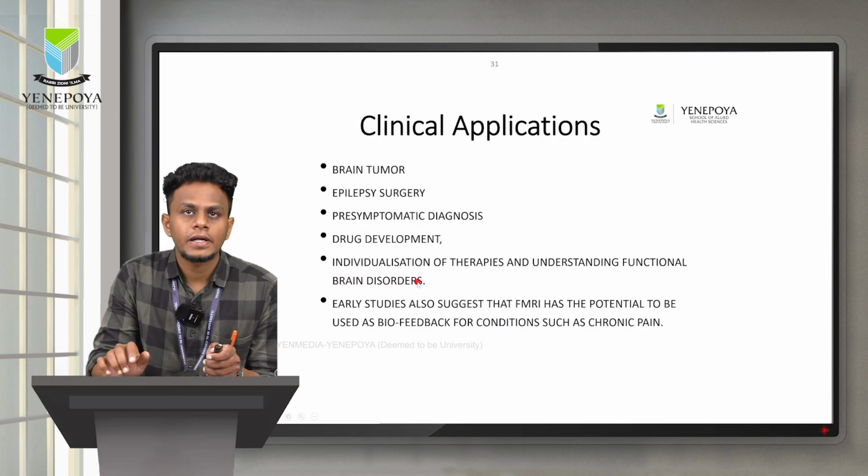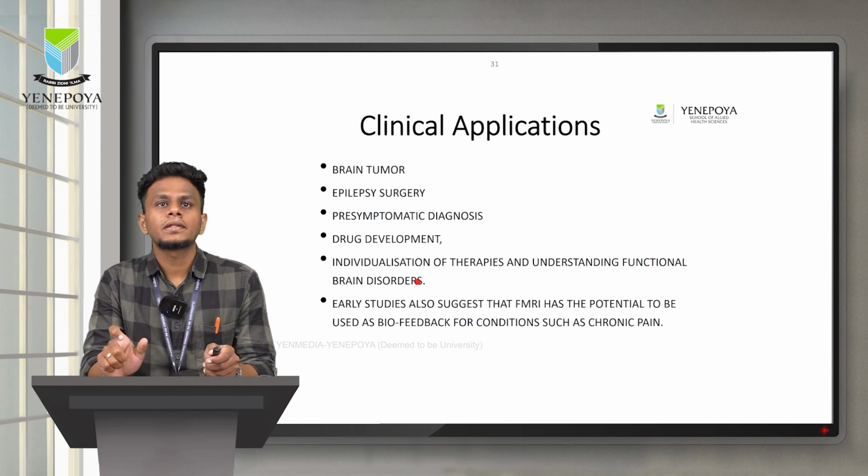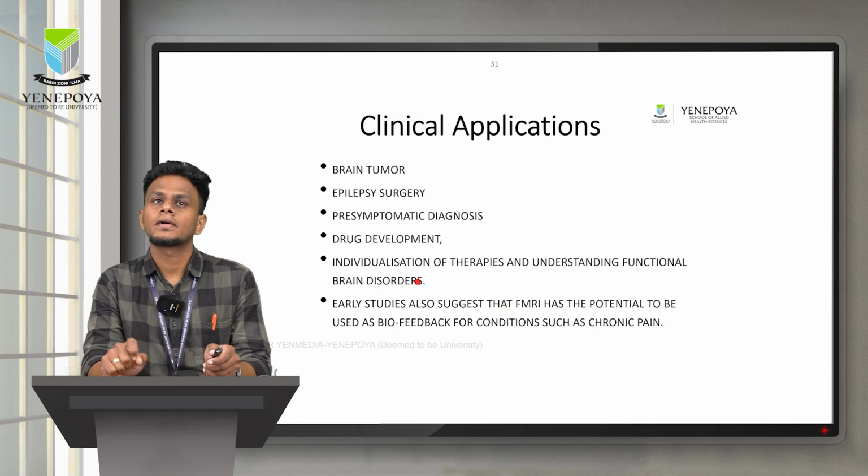Talking about the clinical application, the main thing is that it is very helpful in brain tumor surgeries or epilepsy surgery.